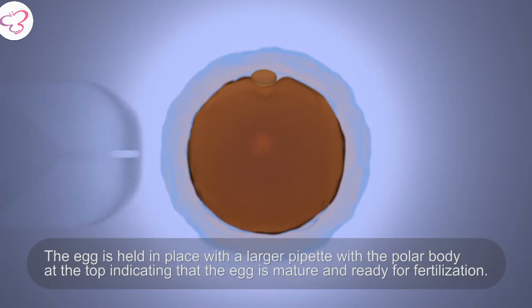The egg is held in place with a larger pipette with the polar body at the top indicating that the egg is mature and ready for fertilization.